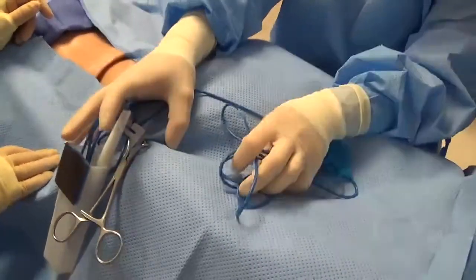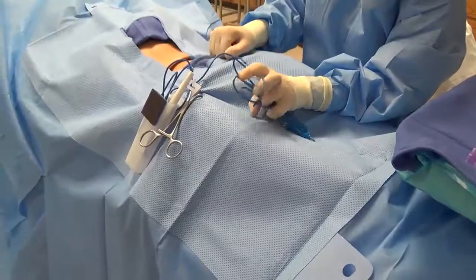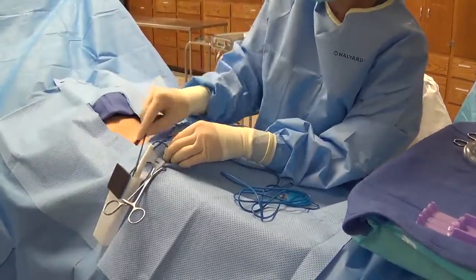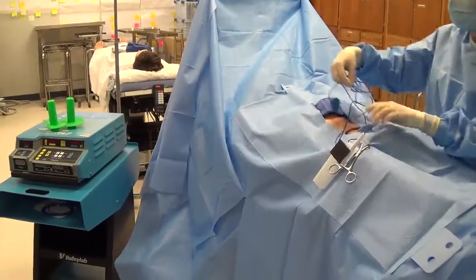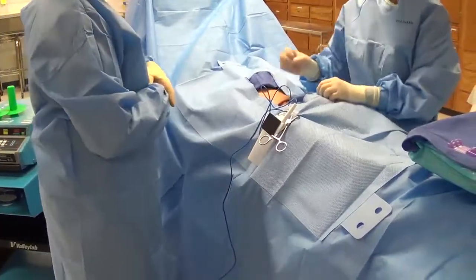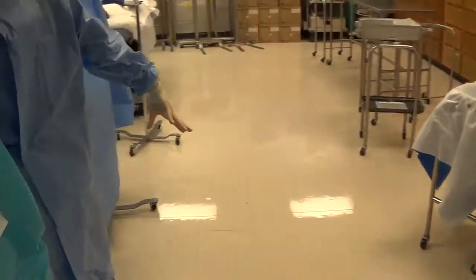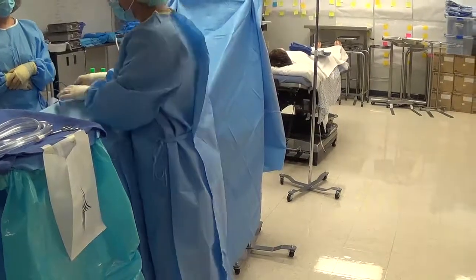Attach the clip before you toss the cord off — if you toss it off first and then mess with it up here, you'll probably bring something back onto the field. Double-check that you have enough length to reach the incision site, then check which side the cautery machine is on before throwing it off, so you toss the cord in the correct direction. Keep your hand at sterile field level when tossing — don't let your hand drop or reach behind yourself.